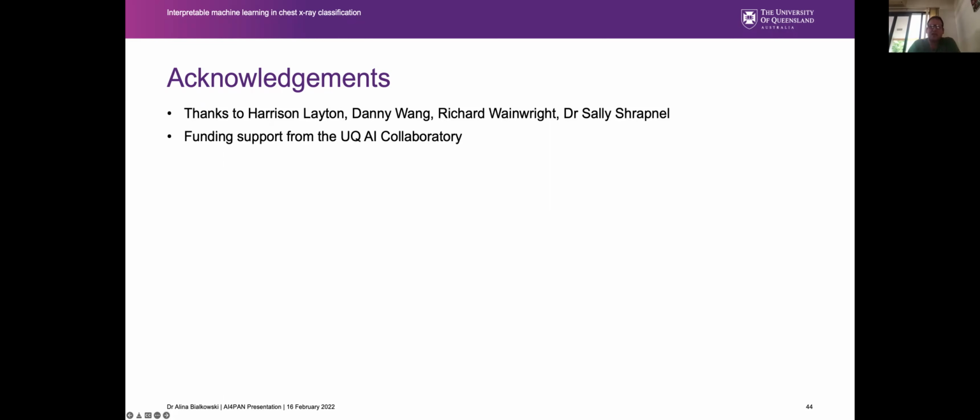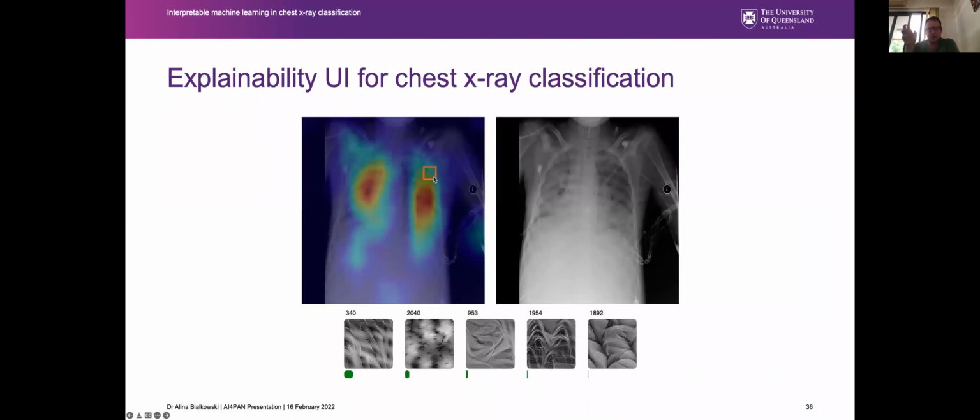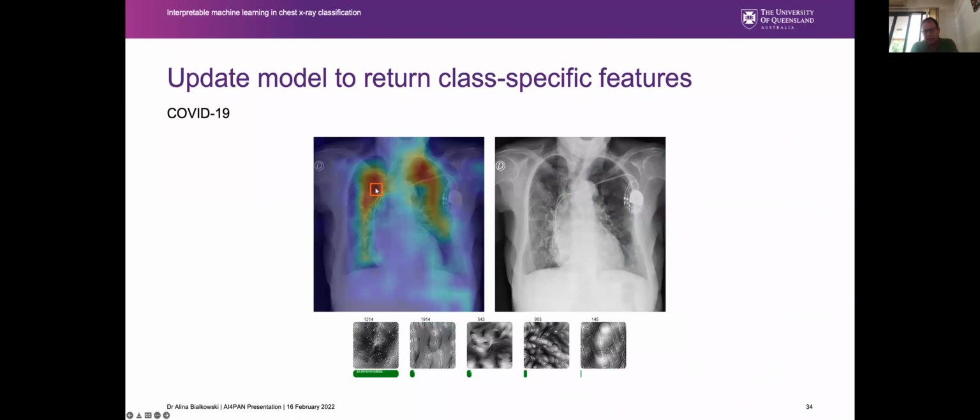Okay, thanks. So about GradCam. If I understand, you use GradCam to find features in the original input channels that are most dominant in making the prediction. So from a statistical point of view, if you think of mixed models and statistics, one may try and remove those features and then look at what's left. Say you have dominant features that discriminate over age, it's clear that age is a major factor in COVID-19. So you remove those, mask them out, and then you go further. Is there any hope or work on that?